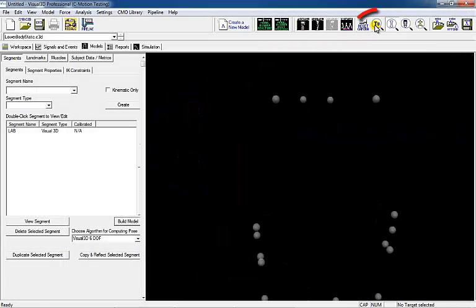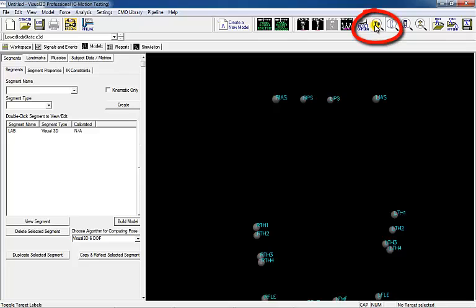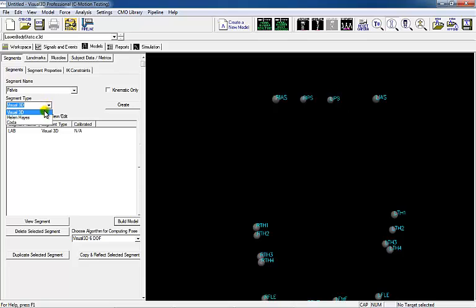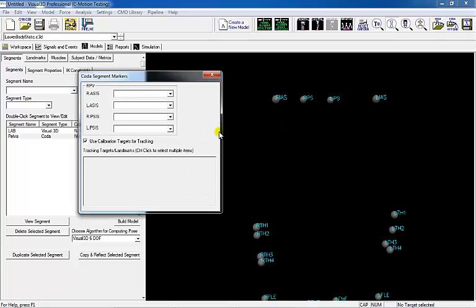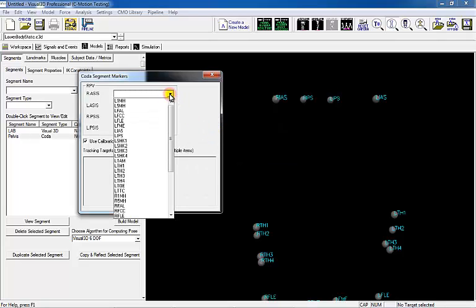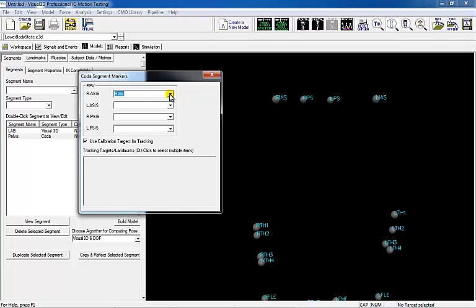Once the target IDs are turned on, the target IDs will be displayed in the 3D viewer. There are many possible marker sets for a pelvis segment that make sense anatomically and have a history in the biomechanics community. The COTA Pelvis will create hip joint centers automatically using estimates from the Bell and Brands articles for prediction of hip joint center.